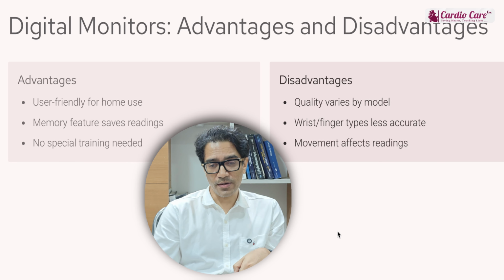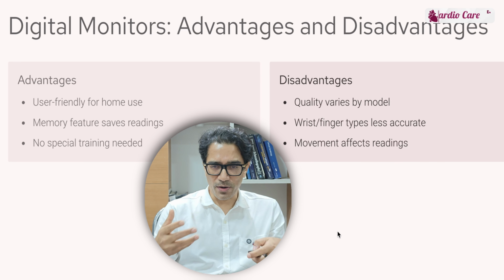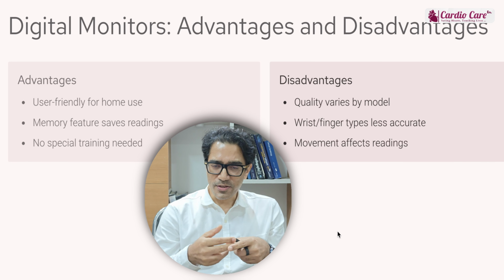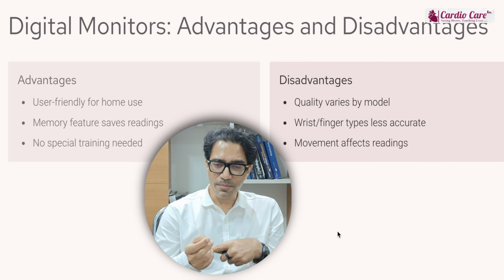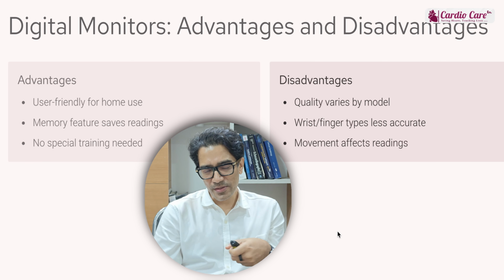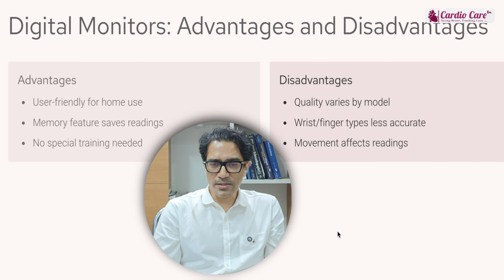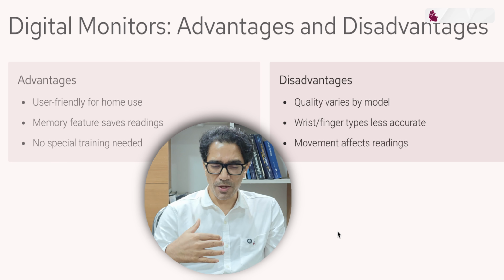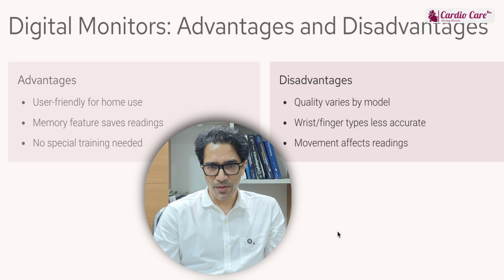So what are the disadvantages? The disadvantage is that the quality varies from model to model, so you have to know which model to choose. And as I have discussed, the wrist and finger-based digital monitors are less accurate compared to arm-based ones. Another important disadvantage is that it can be quite erroneous, especially if the patient is moving or if there is an irregular heart rate. In all those conditions, it could be erroneous.